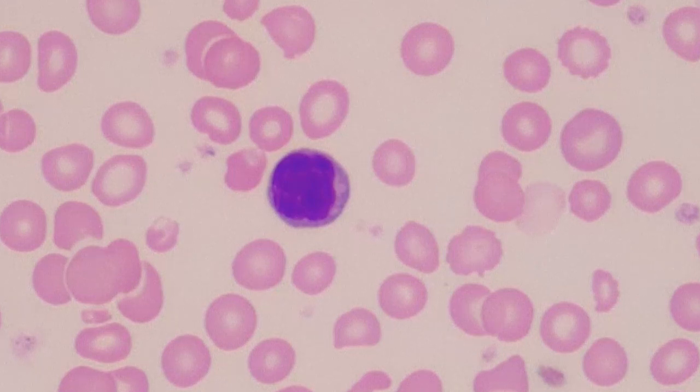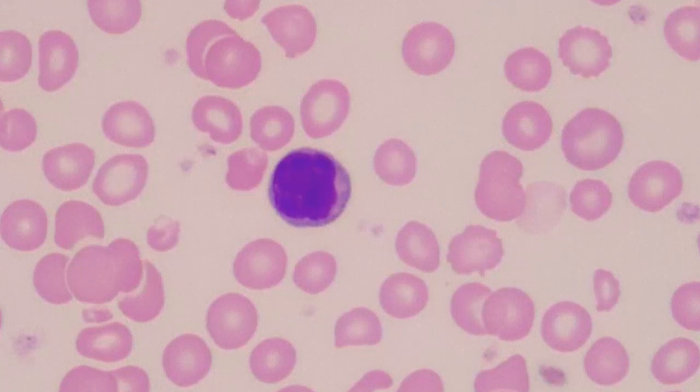In this video, we are going to look at microcytosis. So even before we put the slide on the microscope, we're going to look at the analyzer printout. And the red cell indice that's going to give us information about what we can expect to see is the MCV, the mean cell volume. And the normal range on that, depending on your source, typically tends to be like 80 to 100 femtoliters.